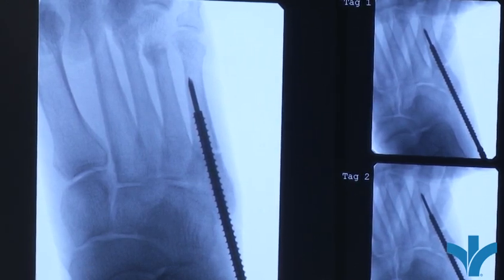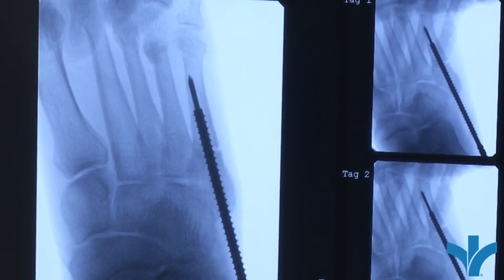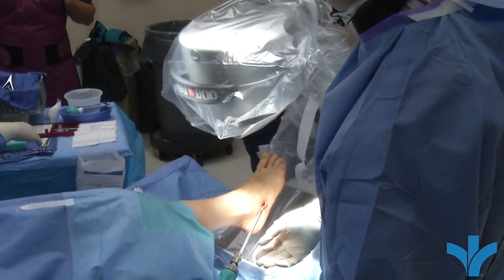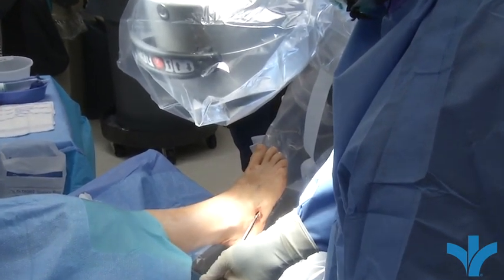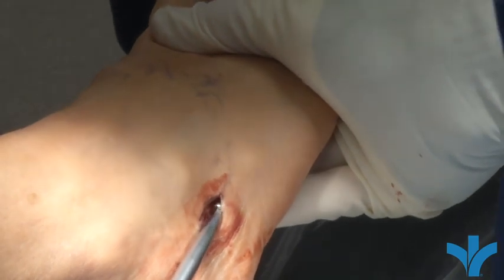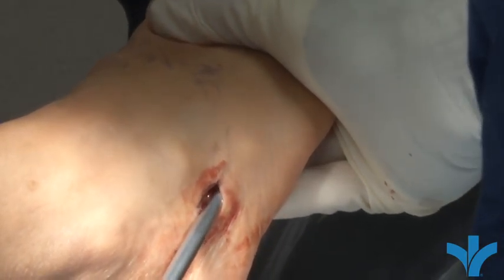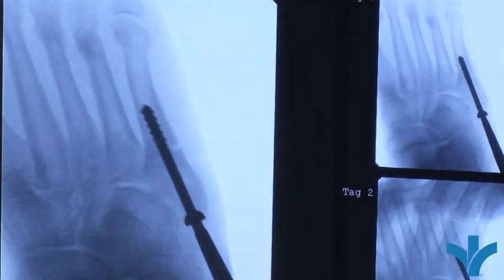Now that we've done all the tapping, we'll put the actual screw in. The actual screw is solid, and solid screws are four times stronger than screws with a hole in the middle. We'll go slowly and check to make sure we're putting this thing exactly where we want it. You can see the screw head going into that small incision in the side of her foot. Watch very carefully at the x-ray — you can see that gap disappearing as we put the screw in. Usually you can get a pretty good purchase or bite on these screws, and that's what helps them heal up.